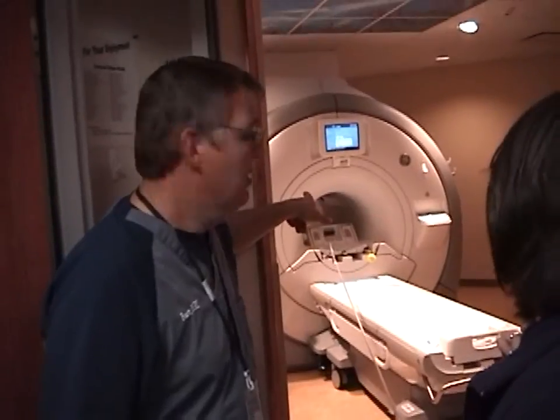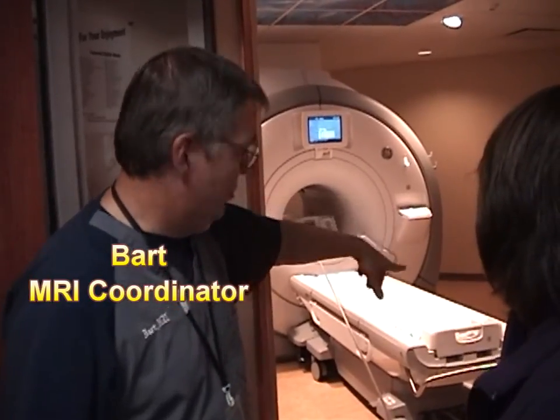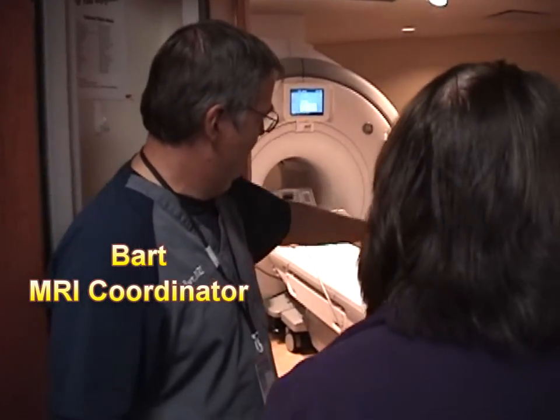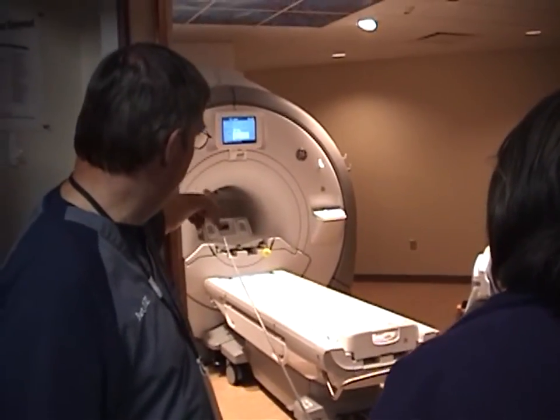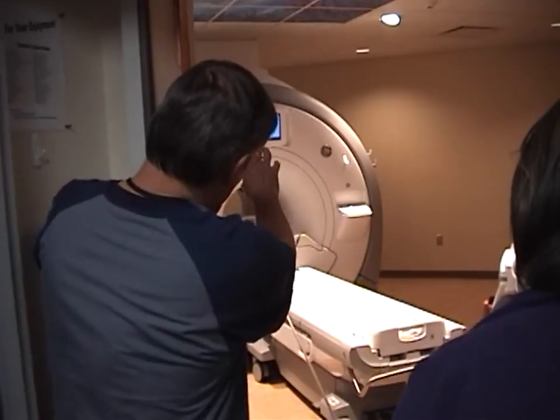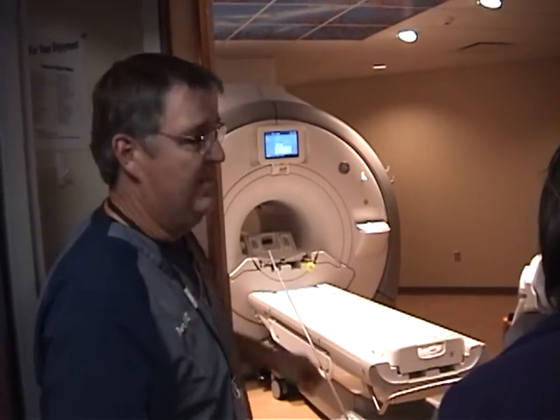We can cut down scan times and get the same images we could at other facilities in half the time. So you'd lay on the table — if we were doing your spine, you'd be laying on the spine coil. You'd lay on the spine coil on the table, and it would raise up and hook to the scanner, and then pull you in.